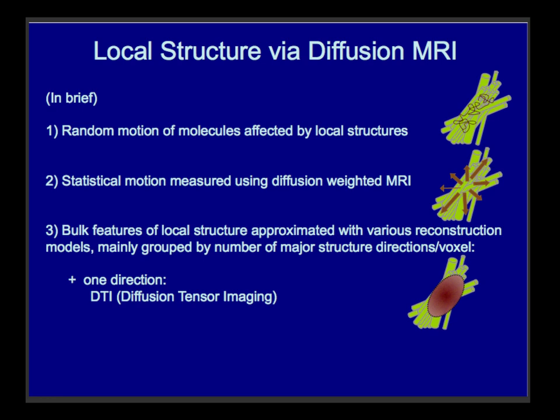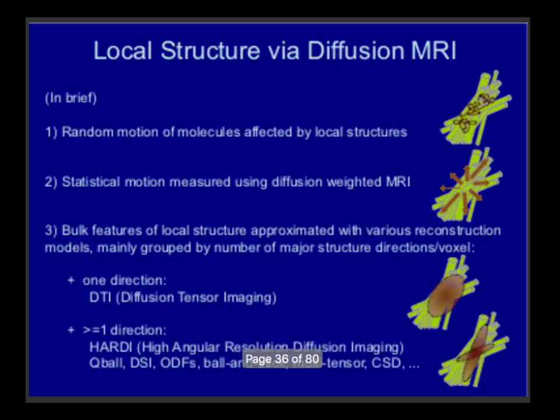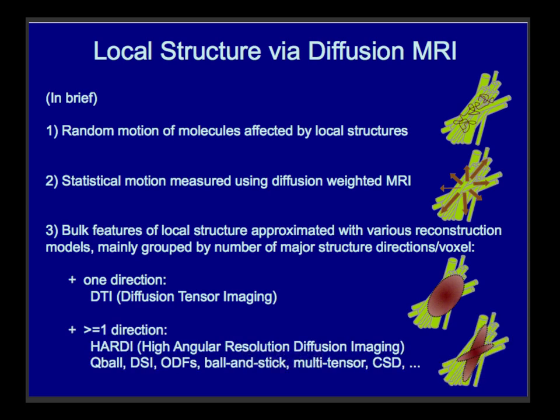So we don't have this. I'm showing the green background here, but we don't have it. That's what we're trying to estimate. And if you notice, in this case, actually, there's lots of structure. It's not just a set of straws all uniformly oriented. And it is true that in any given location we're looking, the structure will probably be complicated. And we could try to say, well, can I get a sense of this finer, more complicated structure? And there are ways to try to do that. I'm not going to talk about them here. Everything I talk about related to DTI relates to these other diffusion-related methods. It's just slightly more complicated.